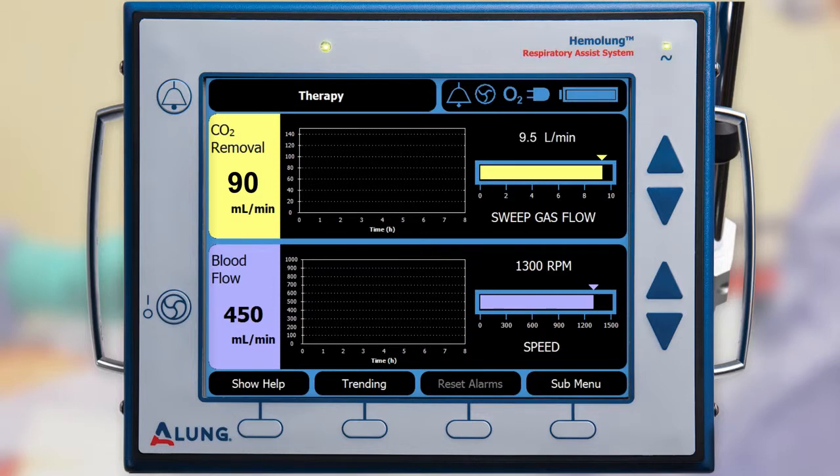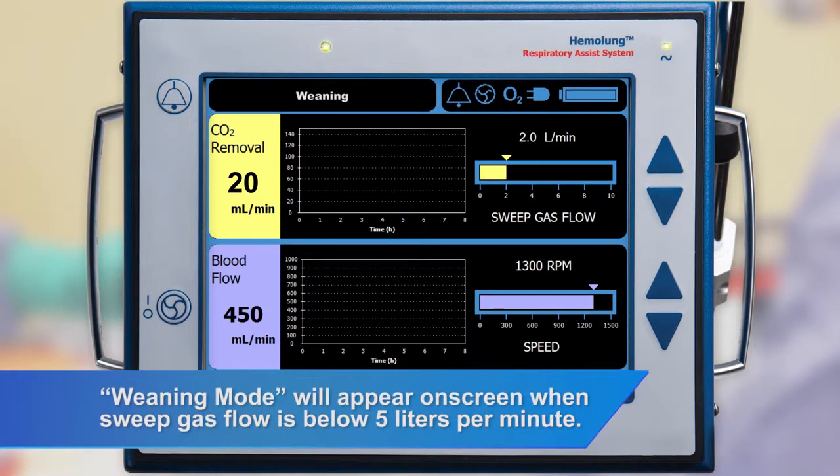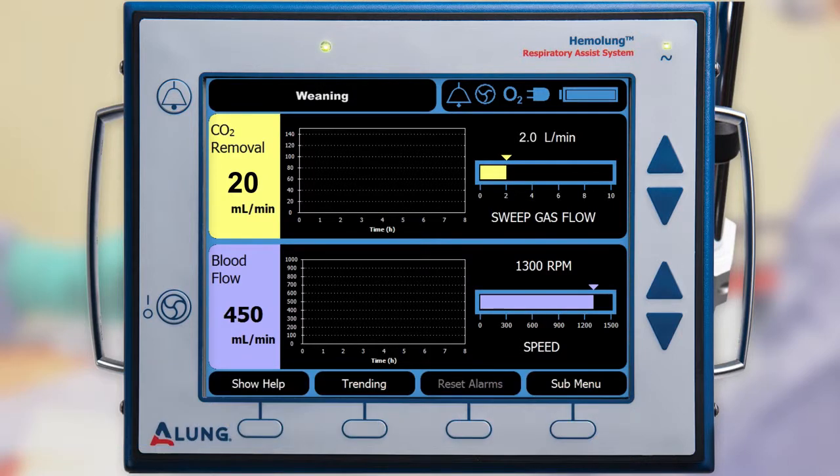Weaning from therapy is done by progressively reducing the amount of CO2 removal while closely monitoring the patient. To reduce CO2 removal, reduce the sweep gas flow rate. After reducing the sweep gas flow rate, the new CO2 removal rate will display on the screen after approximately two minutes.